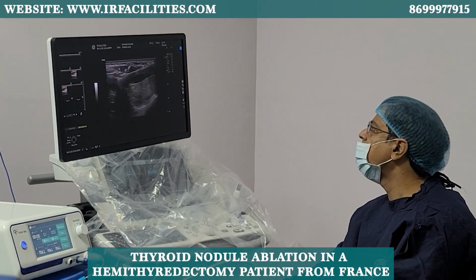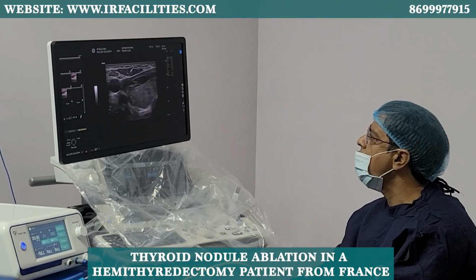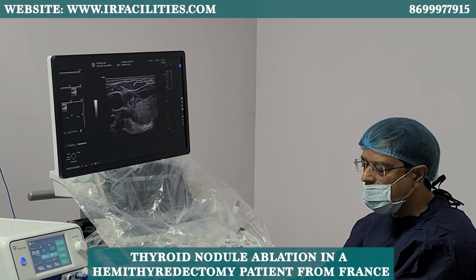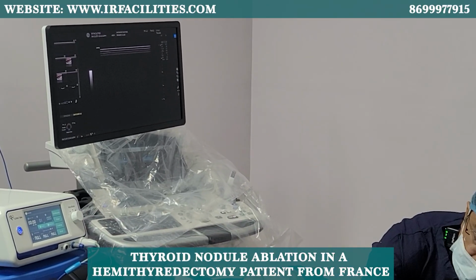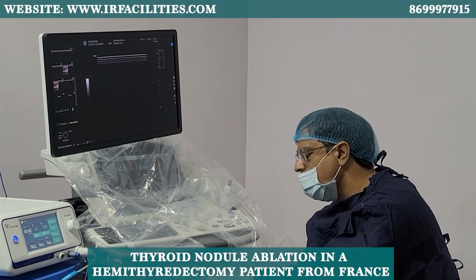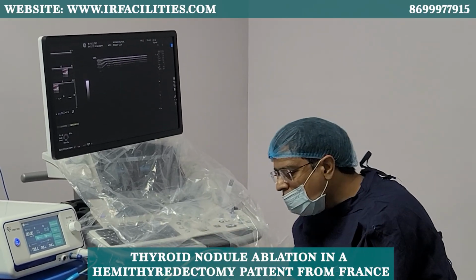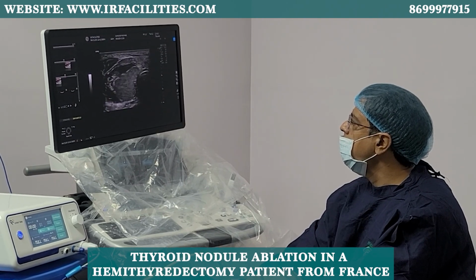So she has all the lesions I'm seeing now. So in this case we'll use more of moving shot for the simple reason that she has multiple lesions and small lesions. I can see at least 3. Now what I'll do is to go behind the thyroid.